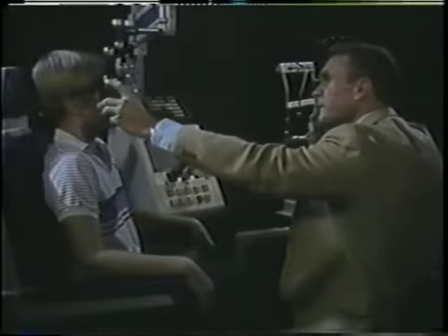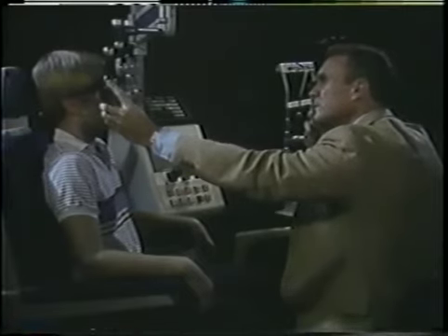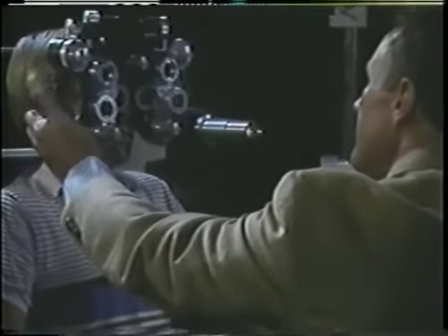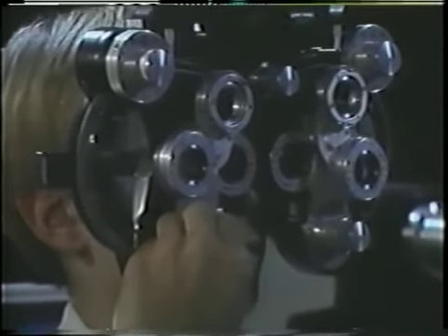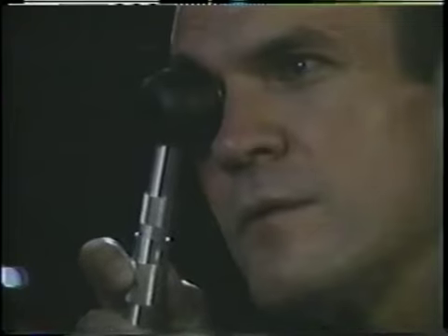Retinoscopy, a simple yet powerful technique for determining the refractive correction for the eye. An objective technique which requires no decision or response from the patient, retinoscopy is used for refracting children and often for the initial refraction of adults. Retinoscopy is taken for granted by most refractionists, but is not easy to teach or to learn.